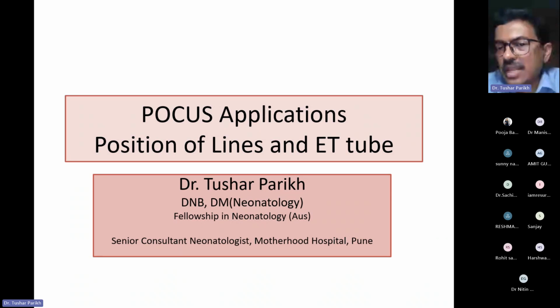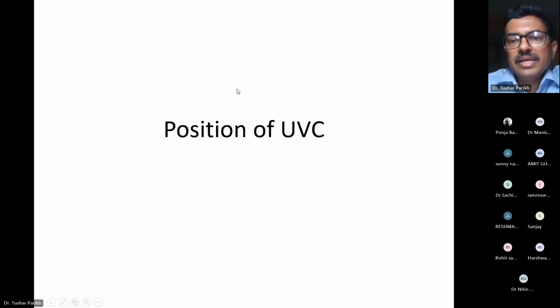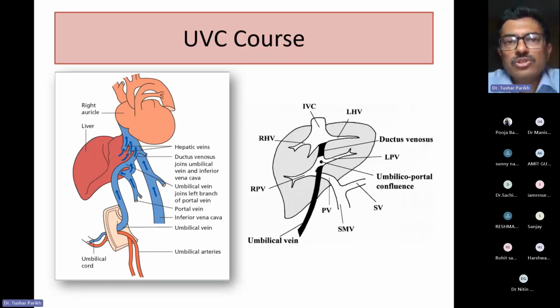Now, as I said, these lines by themselves are not ultrasound opaque or ultrasound friendly. But what we can do to identify these lines, I will talk about it. So basically, first we'll take the umbilical venous catheter. For this, we need to understand the course of the umbilical venous catheter.